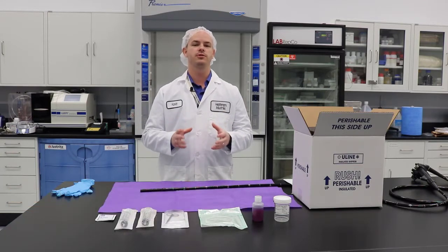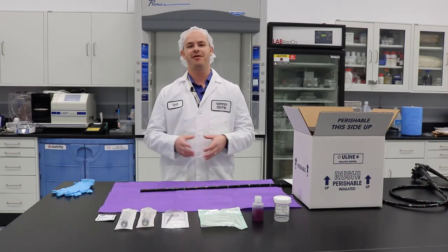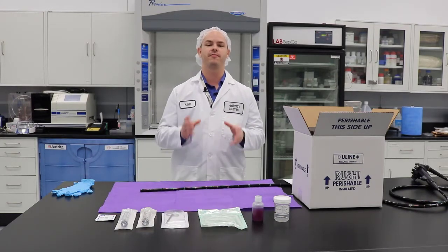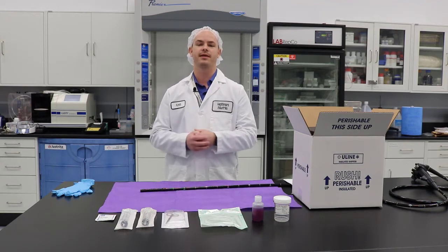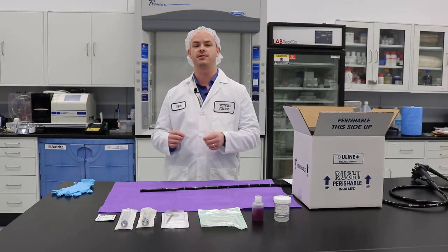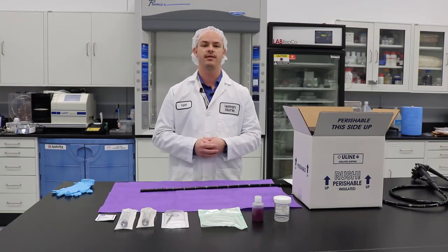Hello, my name is Kevin Anderson, one of the clinical education coordinators here at Healthmark Industries. For this video, we wanted to show you how to use what we call the FES kit. In case you don't know what the acronym is, it's for Flexible Endoscope Sampling Kit. This is how we're going to perform microbial surveillance for flexible endoscopes.